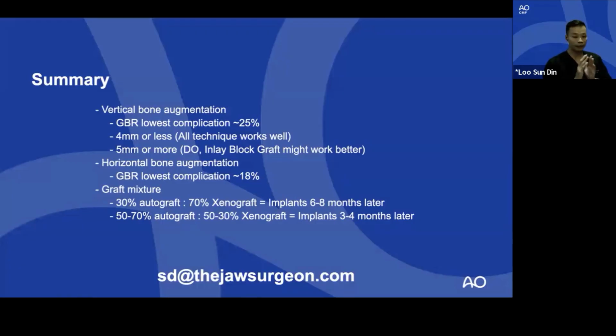Yeah. But in terms of taking block graft from the ramus, I don't really find much use for it because GBR with suturing or bone tacks actually works so well, and it just doesn't make sense to go there and add another site and increase pain and suffering and prolong surgical time.